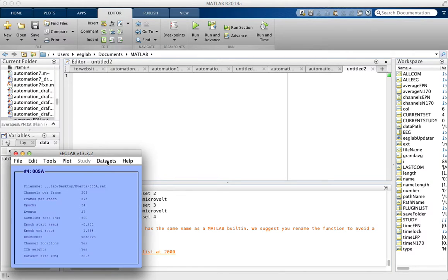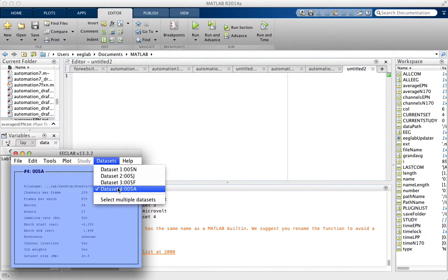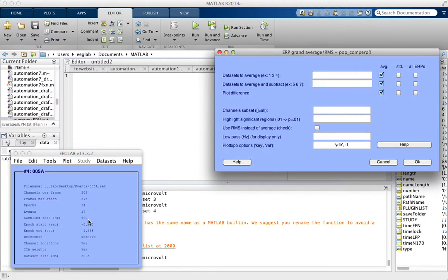We can see the four datasets that we uploaded are all right here, and that we uploaded four. To do the plot, we go Plot > Sum/Compare ERPs.